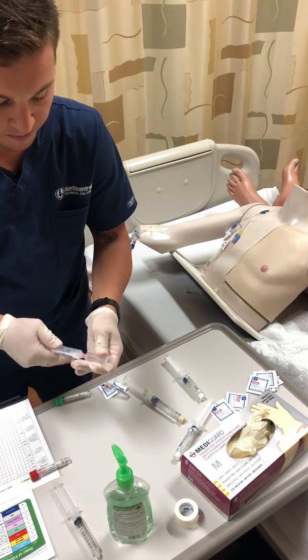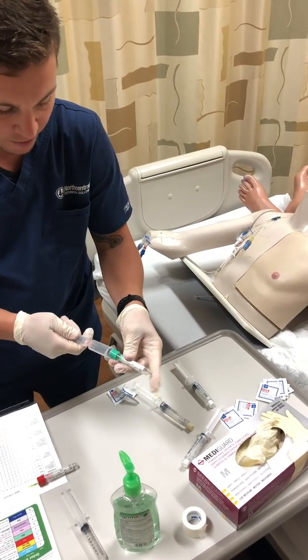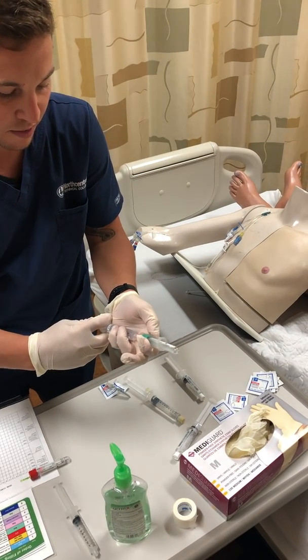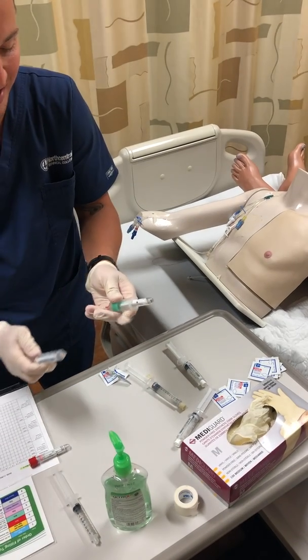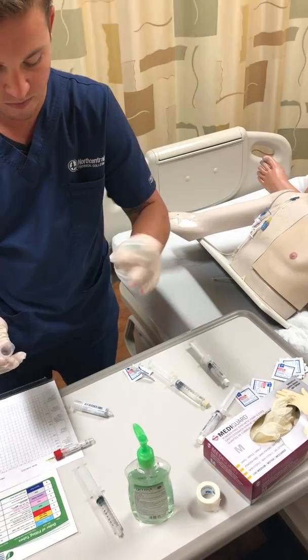This was full of air, so I had to take that off. Okay, so here we're going to insert our next one and take the rest of what we have, the other half. Okay. All right, rotate.